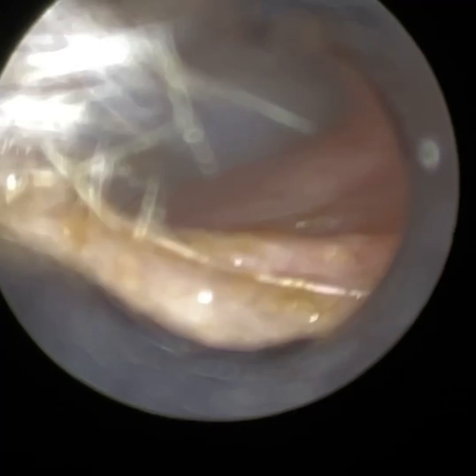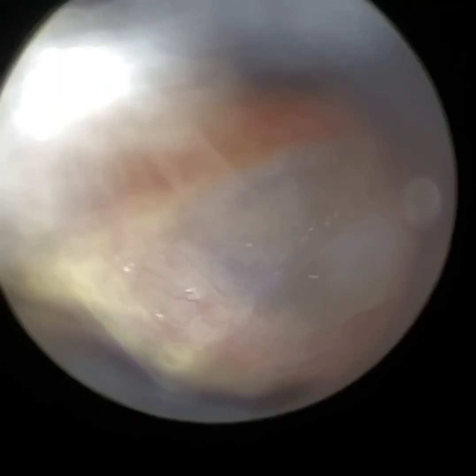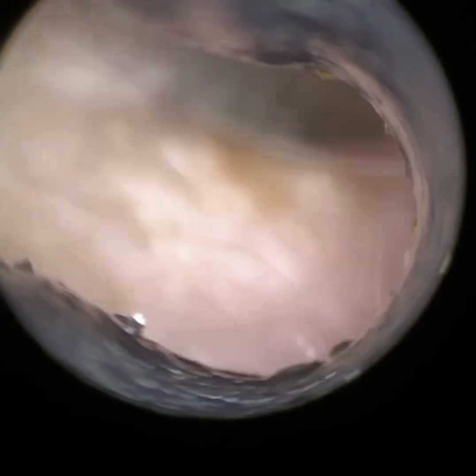I'm just going to re-enter the ear. I'm going to really stretch it open as much as I can, and we're just going to change the focus. This is the patient's left ear, and you can just see how narrow it is. You can see the handle of malleus and the blood vessels there as well.